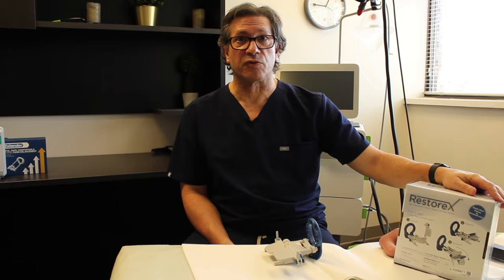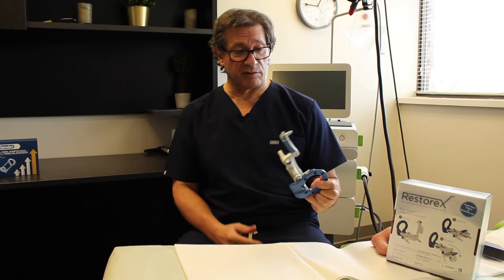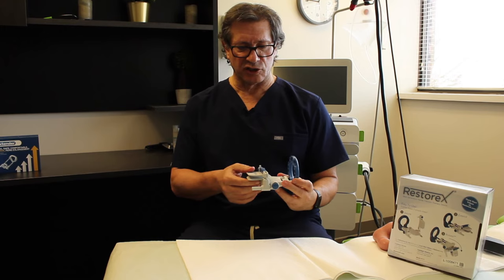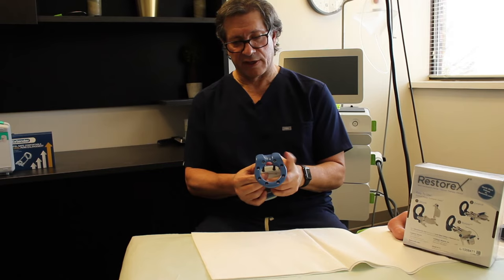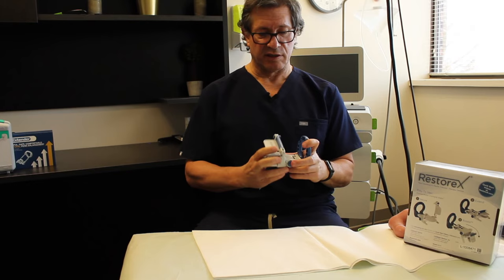The final device I'm going to demonstrate is called the Restorex. It's a US-made device and comes complete without needing any kind of assembly. It's really nicely engineered and comes with a number of nice features, such as the ability to shorten or lengthen the device just by pressing a button.